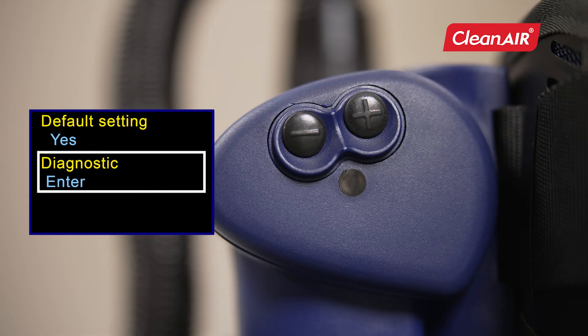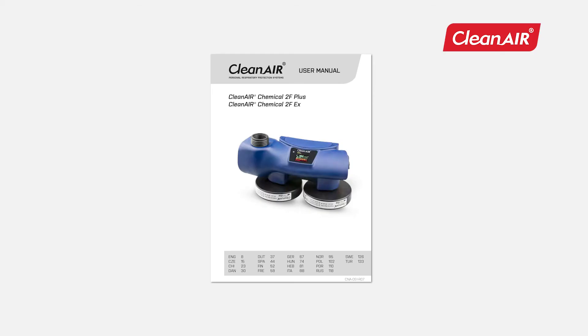Diagnostics is intended for unit service. Press both buttons for two seconds to save the settings and leave the menu. If you are not pressing anything for five seconds, do the same. Other settings can be found in the user manual.